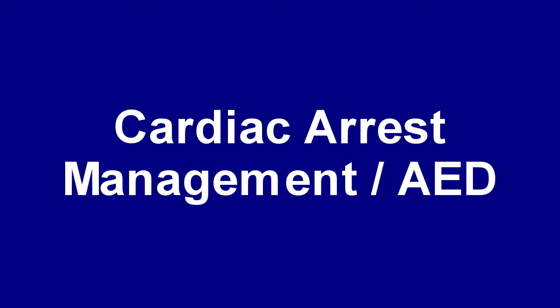The patient's response is not meant to give any indication whatsoever as to your performance in this skill. Please take a few moments to familiarize yourself with the equipment before we begin, and I will be happy to explain any of the specific operational features of the AED. If you brought your own AED, I need to make sure it is approved for testing before we begin. You will have 10 minutes to complete this skill once we begin. I may ask questions for clarification and will acknowledge the treatments you indicate are necessary. Do you have any questions?